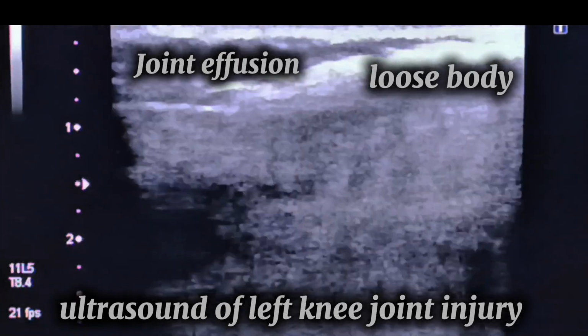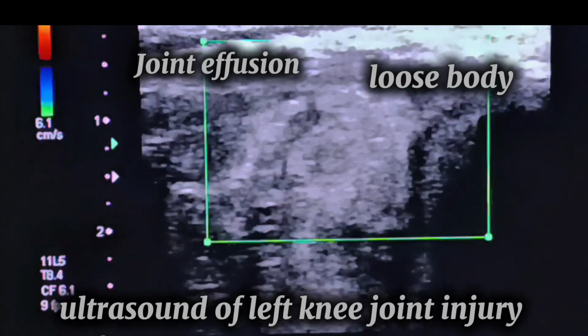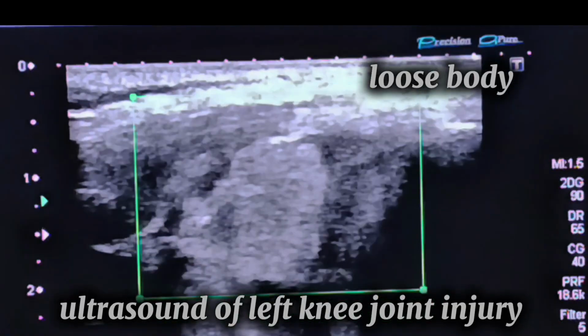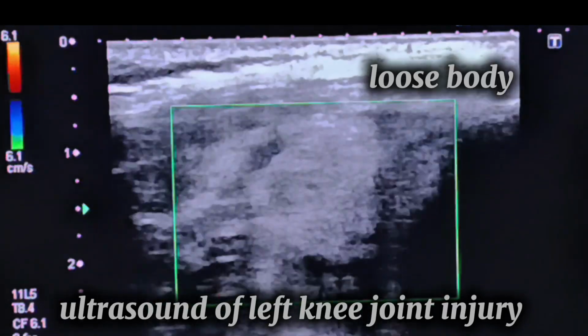Lateral meniscus appears unremarkable. There was no evidence of tear. Lateral collateral ligament appears intact in this view. However, altered joint contour and lateral recess prominence suggested potential maltracking.